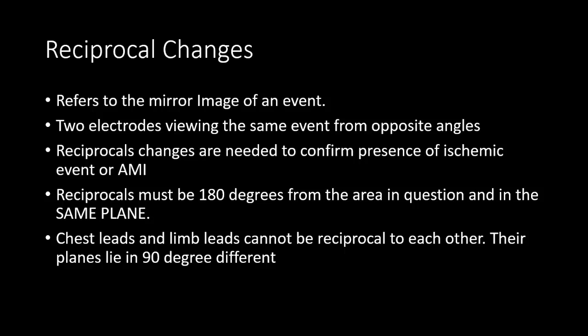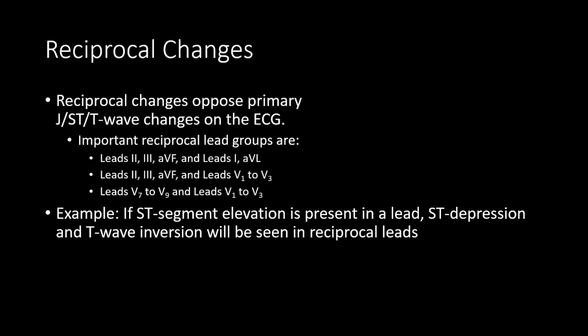Reciprocal changes, mentioned this earlier, refers to the mirror image of an event. So if you have ST elevation, you want to look in the reciprocal leads, and we will discuss reciprocal leads, and see if you've got the opposite. So some of your reciprocal leads are 2, 3, aVF and leads 1 and aVL. So if I've got ST segment elevation in 2, 3, and aVF, which would indicate an inferior MI, then I would want to look in leads 1 and aVL to see if I've got ST depression, which is going to further confirm my diagnosis of acute MI in the field.